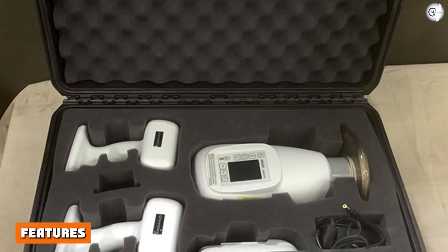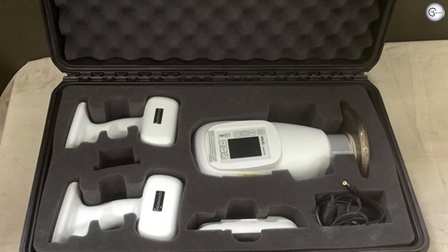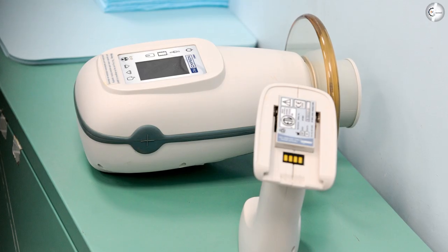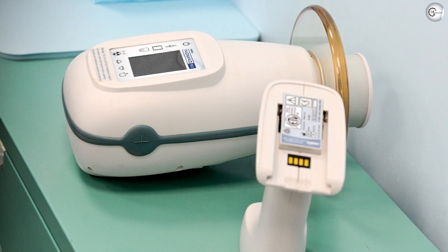Industry-leading battery technology. Incorporating 30% more capacity and longer life than in previous models, the Nomad Pro 2 utilizes premier battery technology that provides a more consistently reliable, long-lasting battery.